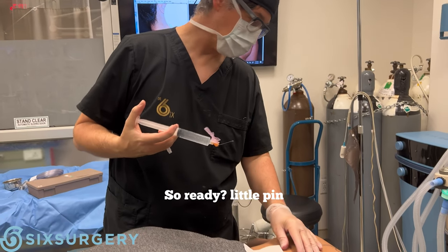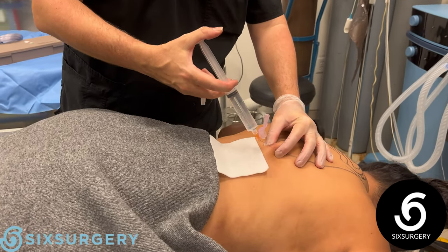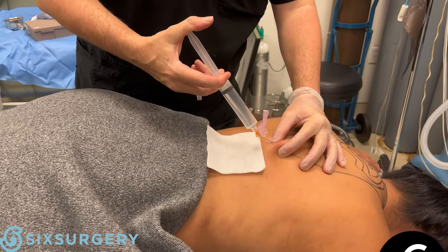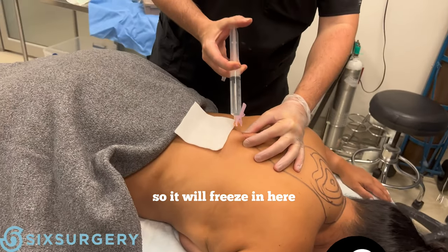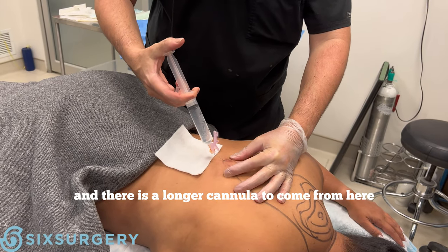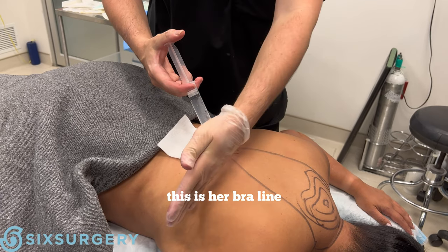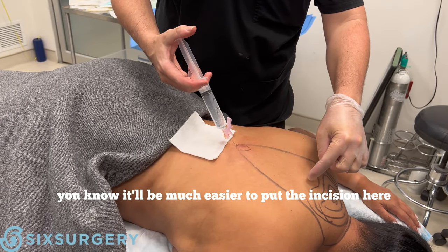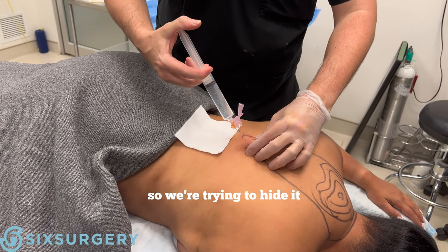First some freezing here. Ready, little pen prick as this thing goes in: one, two, three, poke. We'll put a little freeze in here just to start the process. I'll use a longer cannula to go from here to there. The reason I'm putting the incision here is this is her bra line — you want to hide the scar. It would be much easier to put the incision elsewhere, but that becomes much more obvious, so we're trying to hide it.